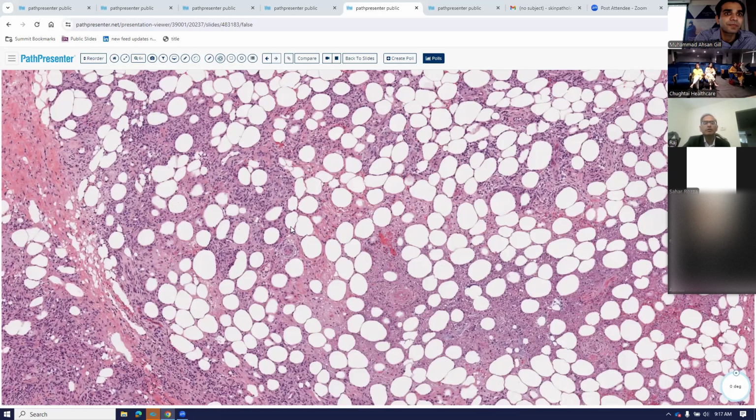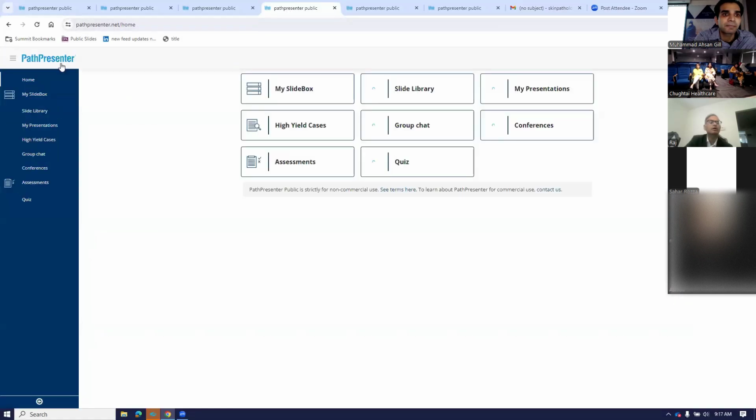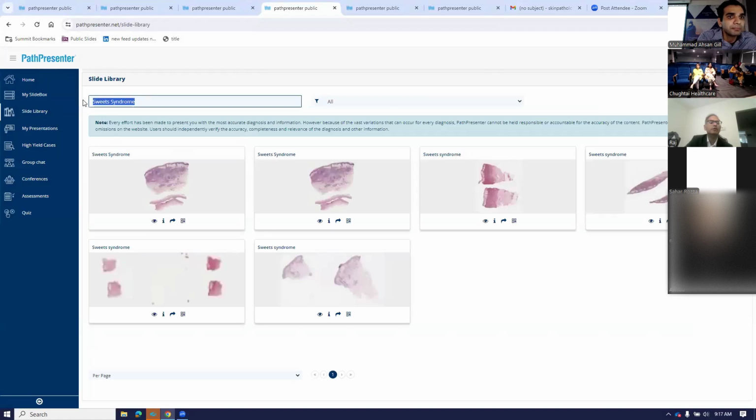Okay, we can talk about that. If we talk about Hailey disease, rather than talking about it, let's do this basically. So let's go here. I'm going to go to the slide library and then type in Hailey.